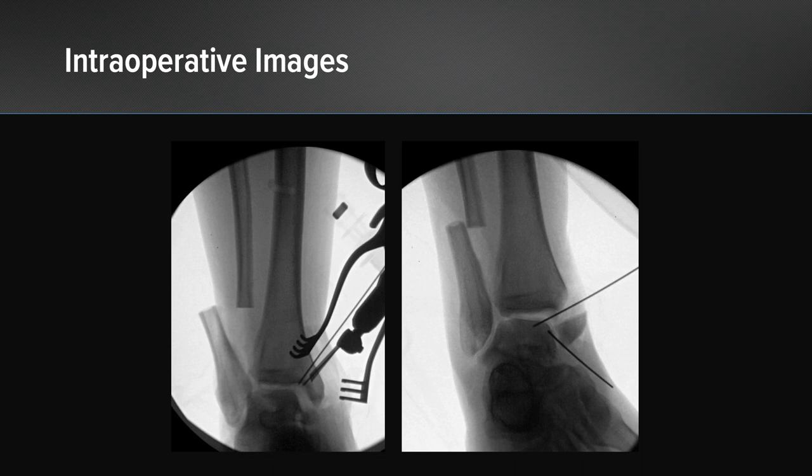K-wires were placed to plan the trajectory for the chevron-type osteotomy of the medial malleolus, which was then completed and hinged distally on the deltoid ligament to gain access to the medial aspect of the talar body. Here we can see the osteotomized fragment taken distally for exposure.